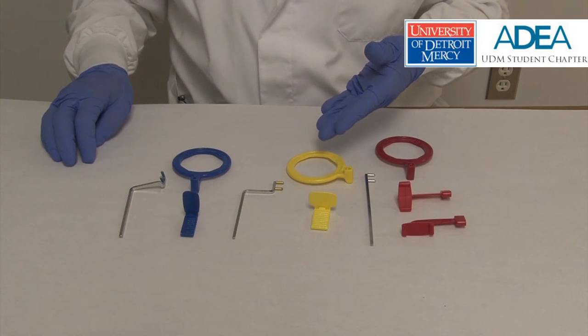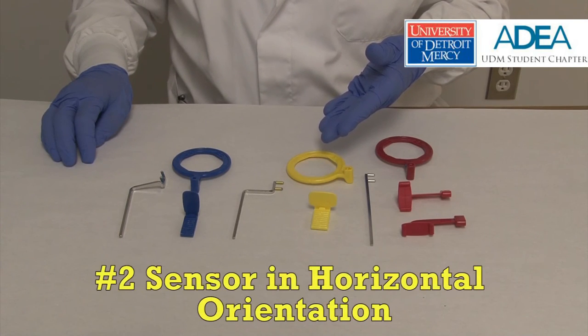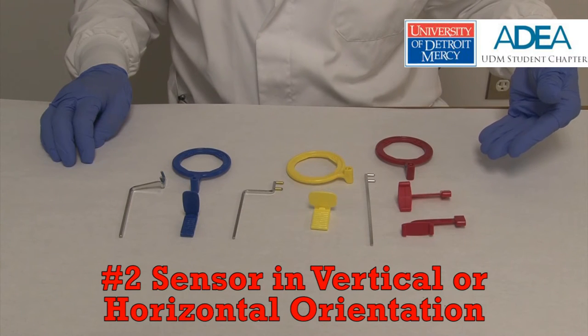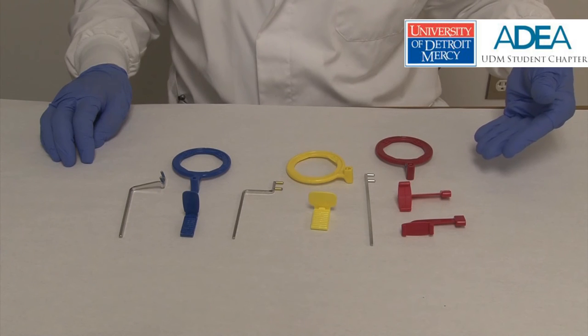The yellow holder holds the wider number two sensor in a horizontal orientation to accommodate the image of the roots of posterior teeth in the flatter, deeper posterior part of the arch. The red bite wing holders can orient a number two sensor in a horizontal or vertical orientation, and those needs will be discussed in a later video.